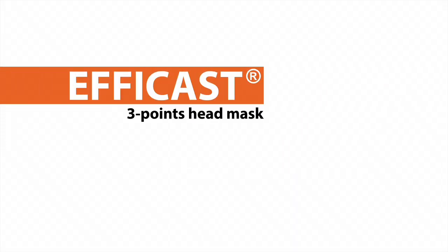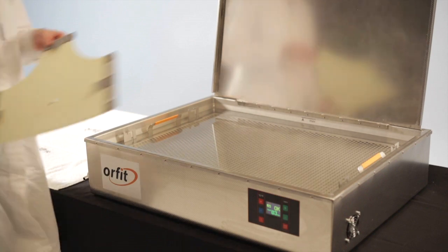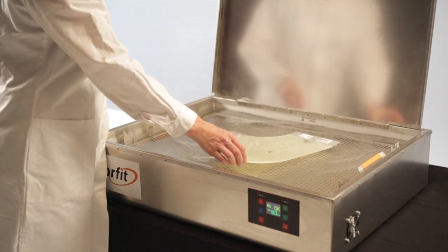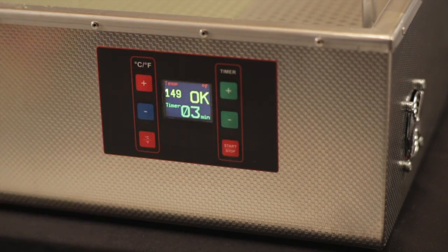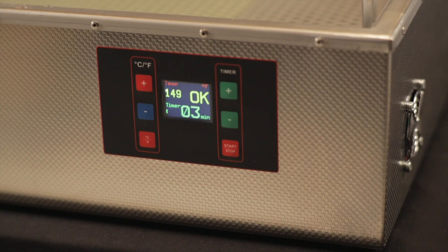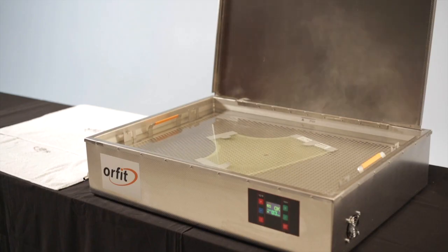3-point head immobilization mask. Place the pre-cut mask in the hot water. Make sure the temperature is between 149 and 158 degrees Fahrenheit. Leave the mask in the water for at least three minutes for a single layer mask and four minutes for a hybrid mask.